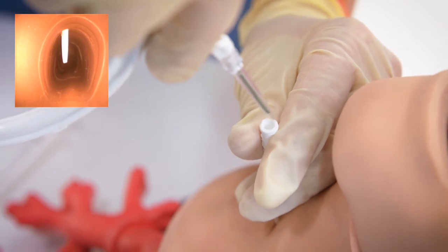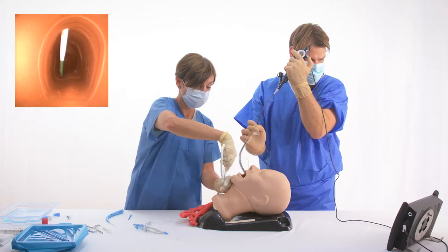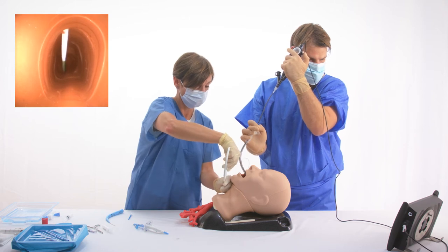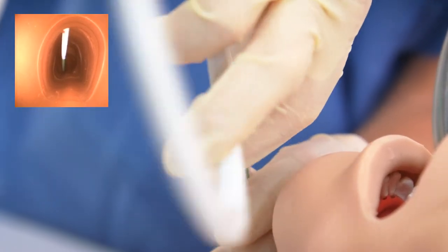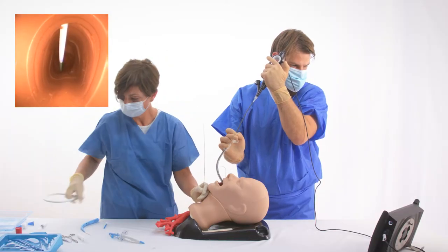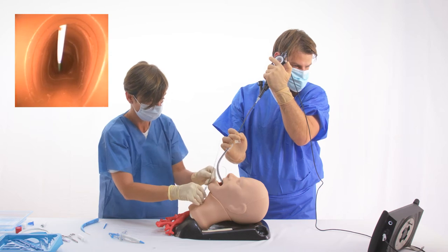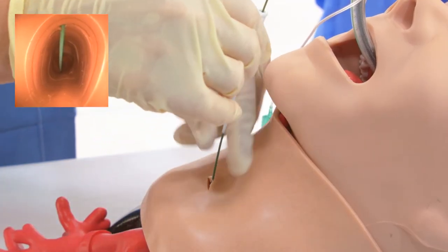The J-tipped wire guide is introduced into the trachea and visualized while advancing distally toward the carina. The introducer is then removed while maintaining the wire guide position within the tracheal lumen.